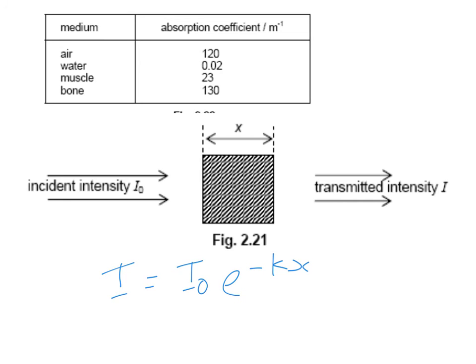For example, do you know that ultrasound can be used for treatment of sports injuries? Let's say you have a torn muscle. They can actually use ultrasound, put it near your muscle, and as it heats up, it will draw blood into your muscle. That carries along with it nutrients and oxygen, so it tends to heal faster. But if your joints have a problem, they won't use ultrasound to treat. You know why? Because your joints are too near your bones, and that causes side effects.